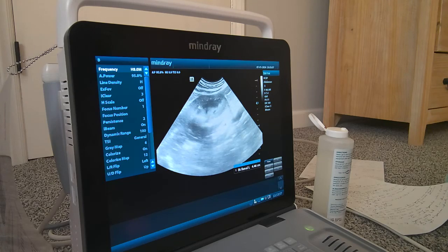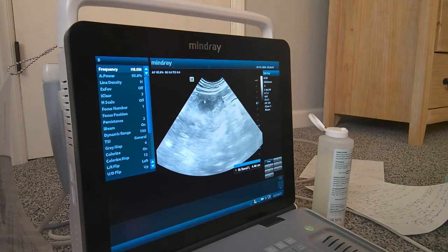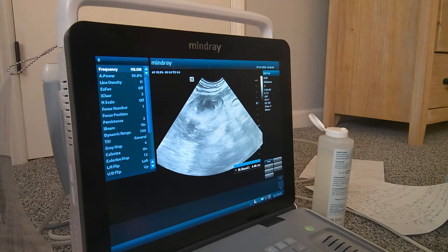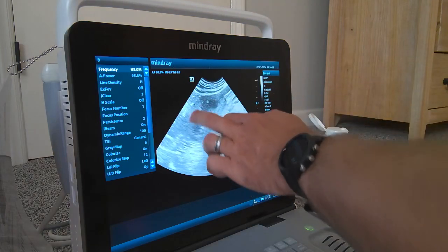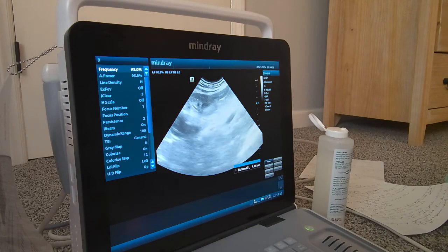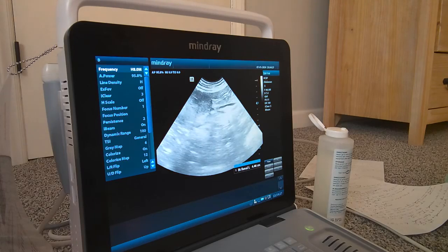Polycystic kidney disease, if it's a Persian, you might see tons and tons of cysts on those guys. Masses: renal carcinomas, hemangiomas, things like that. Hyperechoic masses, maybe some metastatic diseases are sometimes a little bit more hyperechoic. You'll hear people talk about a medullary rim sign, so this hyperechoic rim along the medulla of the kidney. In some animals it may actually just be normal, but in others we can see it with some other diseases too.